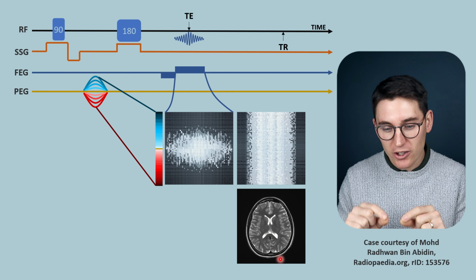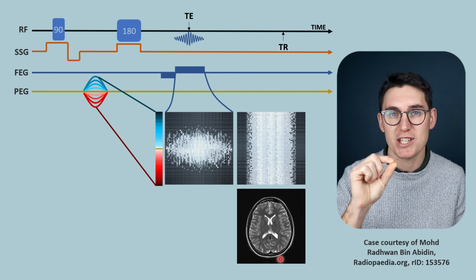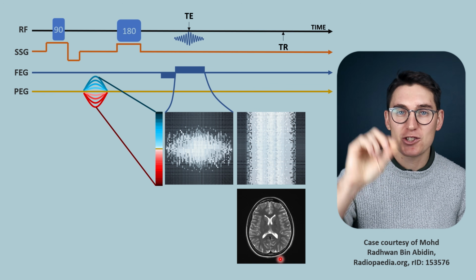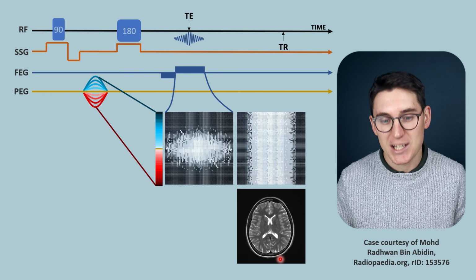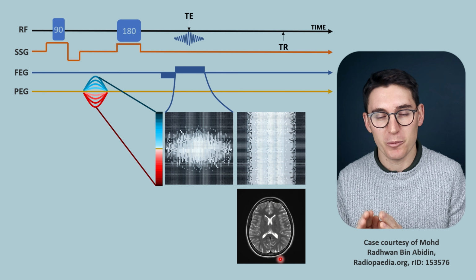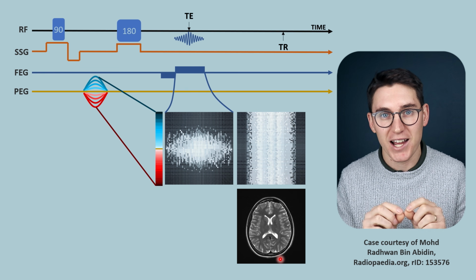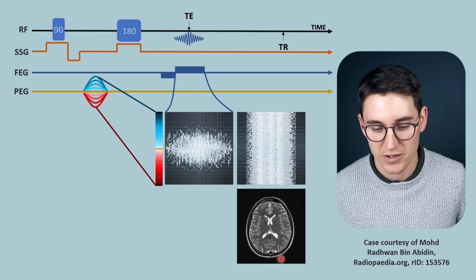Now the process that we're going to use to delineate those 2 separate points is applicable to the process that's used to delineate 256 different points, except in our example we'll only have 2 variables. In actual practical sense, when we're generating MRI images in real life, there are 256 different variables.